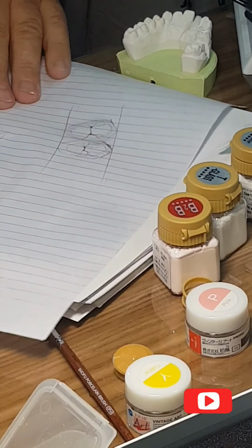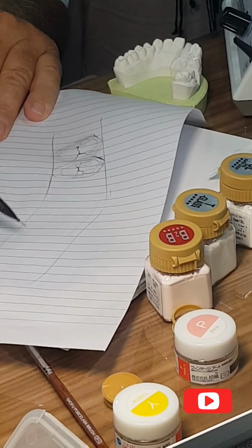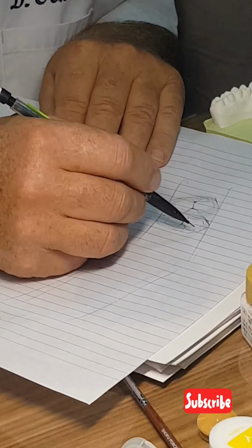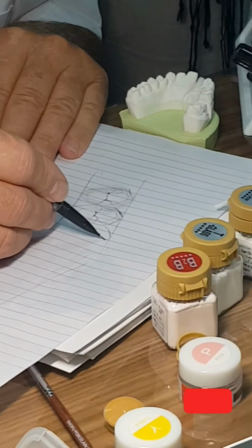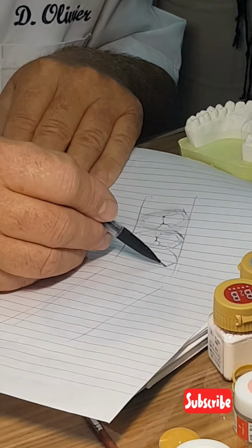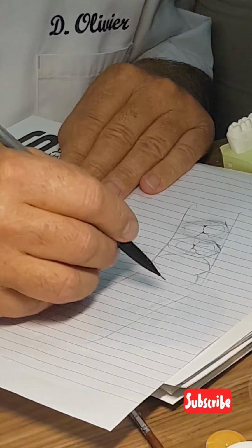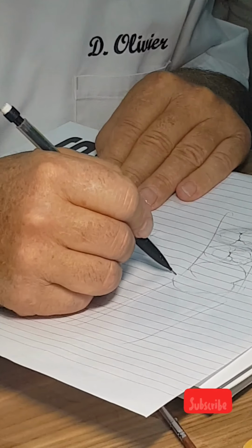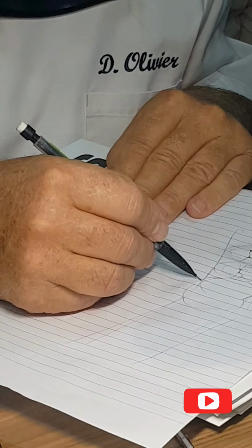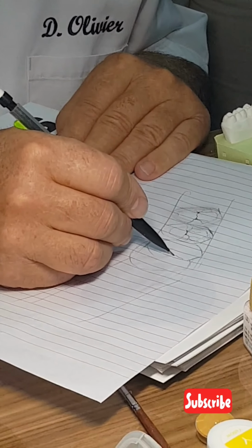So we start from that situation, the entrance of my molar, and slowly it turns, and the second axis is larger because it's a molar now. That means I am going to enter like a premolar, and slowly the crown begins to turn. And look, I have to respect that for the comfort of the patient. I have to enter like a premolar, and I go larger here. And here is generally parabolic. And so I enter like my premolar.